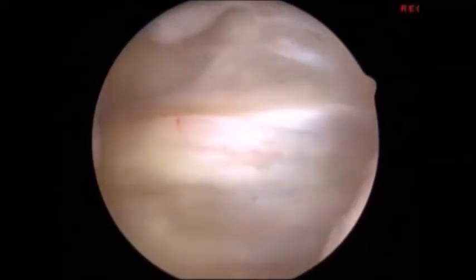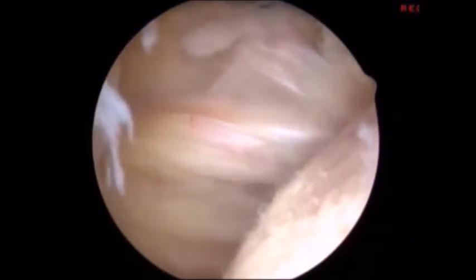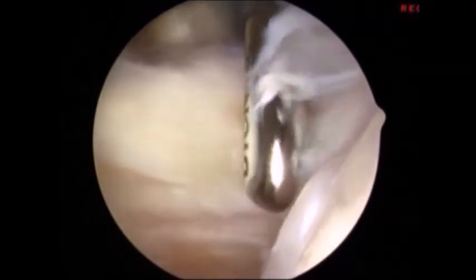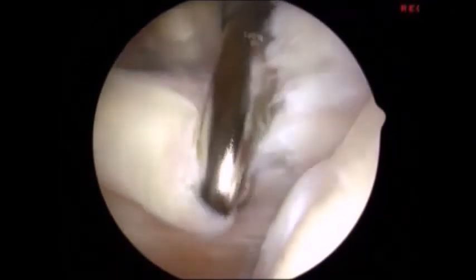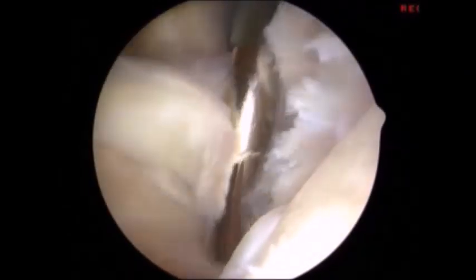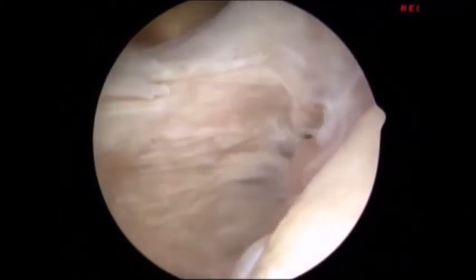Here, yet another example of the subscapularis, right shoulder beach chair position. Again, we can see motion of the tendon itself because of the defect created beyond the margin of the subscapularis surface. Again, debridement of the subscapularis helps to identify the extent of the lesion. Again, we can see significant exposure of the lesser tuberosity.